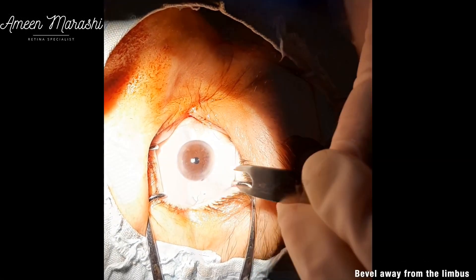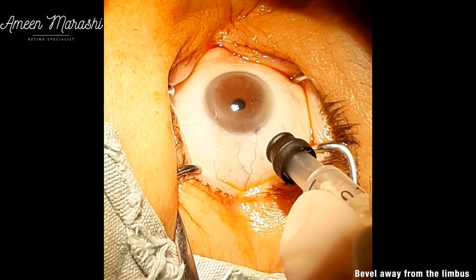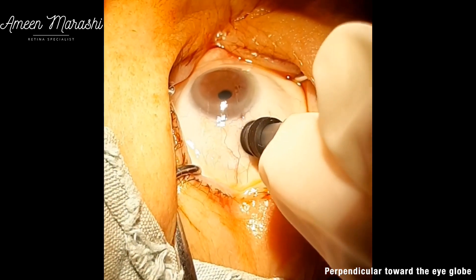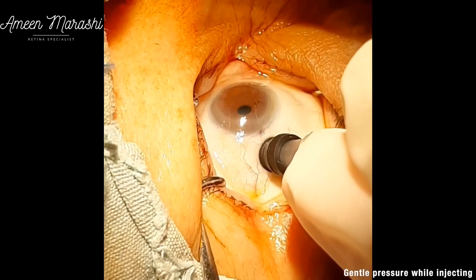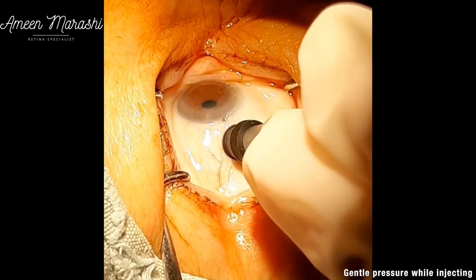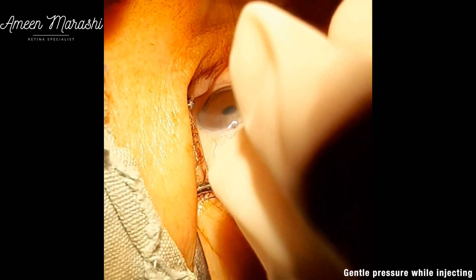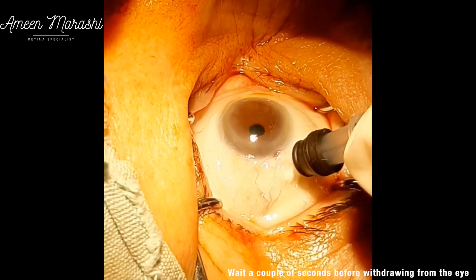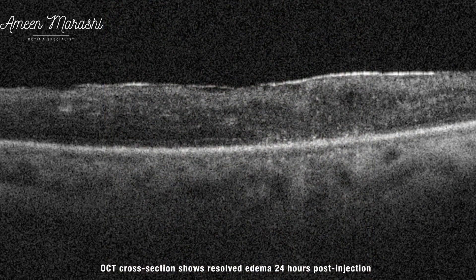The injection technique is to mark 4 mm from the limbus in both phakic and pseudophakic cases. Position the bevel of the needle away from the limbus, insert the needle perpendicular to the sclera, and apply gentle pressure on the sclera while injecting the triamcinolone. Here is an OCT cross-section 24 hours post-injection showing reduction of central macular thickness and resolved cystic formation.